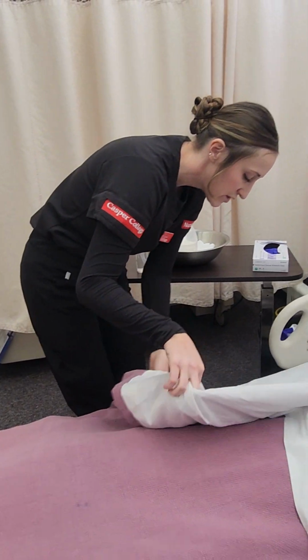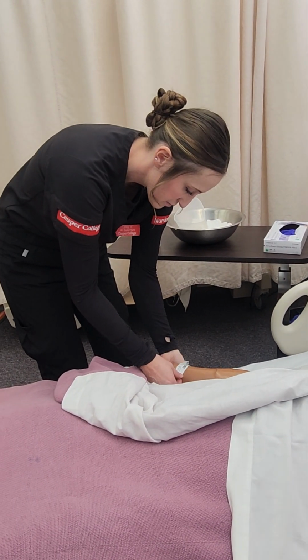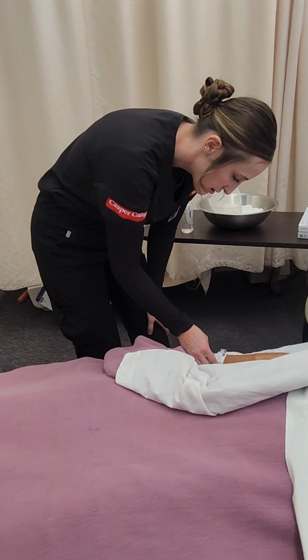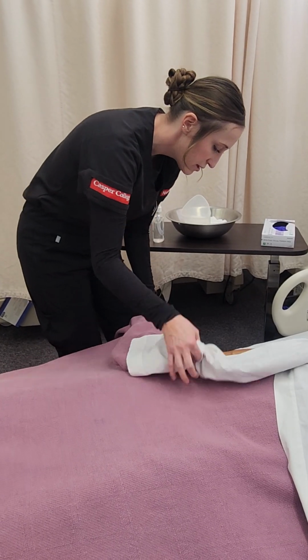Alright. Could you verify for me your name and date of birth? Yeah, it's Jerry Batch, 6/16/XX. Okay, and Mr. Batch, do you have any allergies? I do, iodine. Okay, I see that on there.